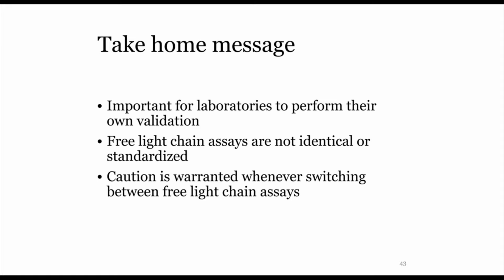Our next question, an audience member says, more than 100 normal patients turned out to be abnormal when tested using the Diazyme test. This number seems high. Do you have any explanation or theory to explain this result? Yeah, so one of the issues is that, remember, the reference ranges are different for the two assays.